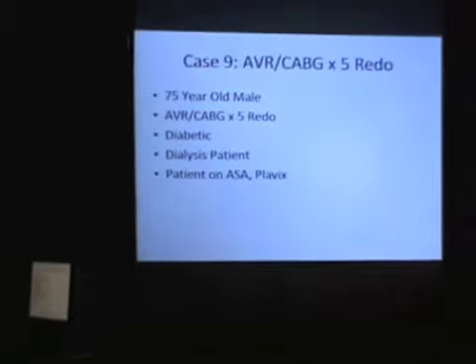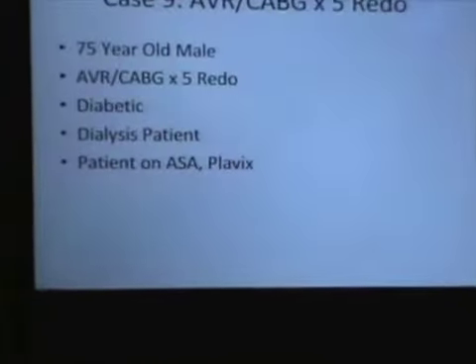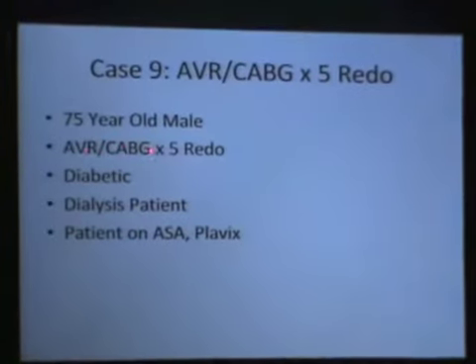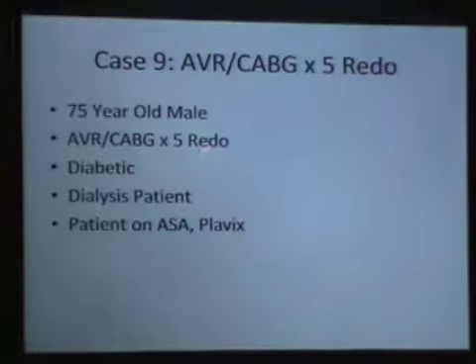Okay, last case, and this is just my favorite case. This is with Dr. Kamina, Dr. Mendenhall. Again, another ho-hum case. AVR, CABG redo times 5, diabetic, dialysis in the room. Okay, patient's on aspirin and Plavix.